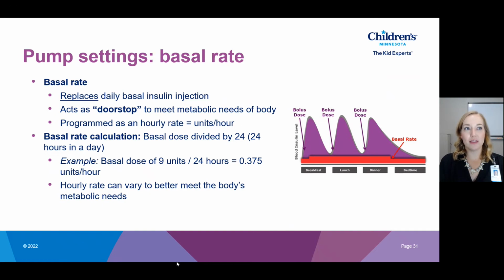The hourly rate can vary based on time of day. Some people find that they need less basal overnight or more basal overnight. And so what is nice is on the pump, you can customize that versus being stuck with the one dose that you administer a day with an injection.